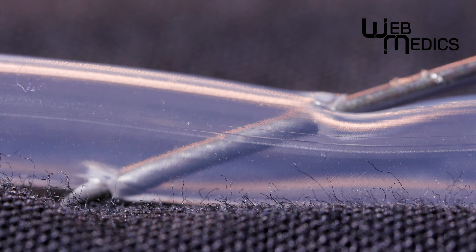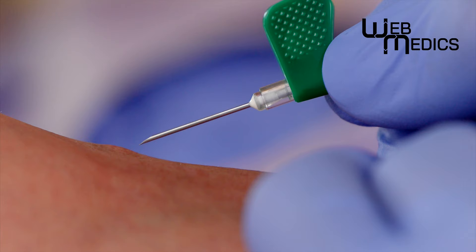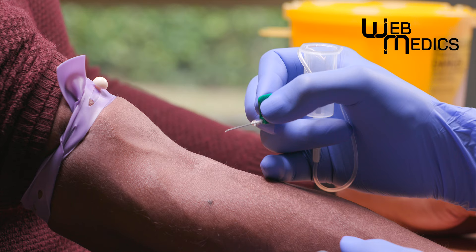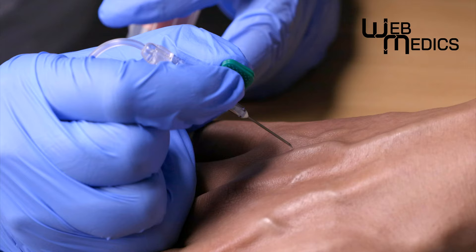There are so many other questions we're working on right now, the most important of which is how to turn a failing blood draw into a success. That's coming soon. But if you take only one thing away from today, remember to always stabilize your hand.